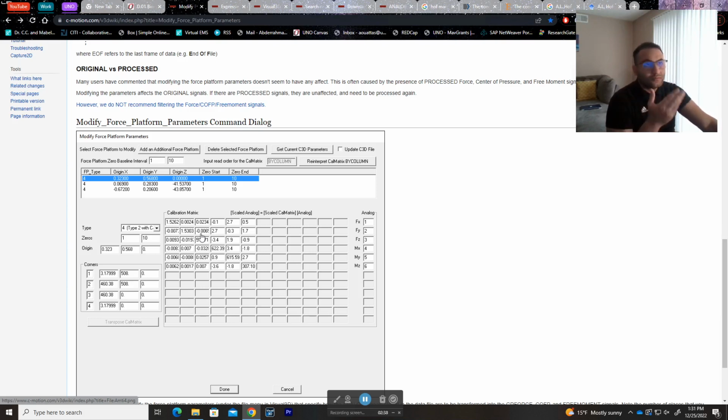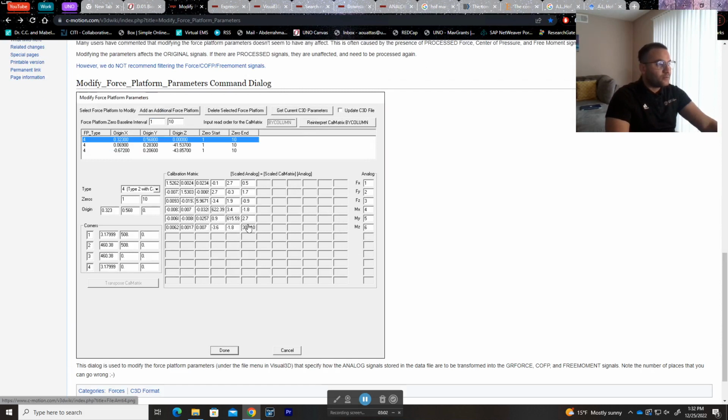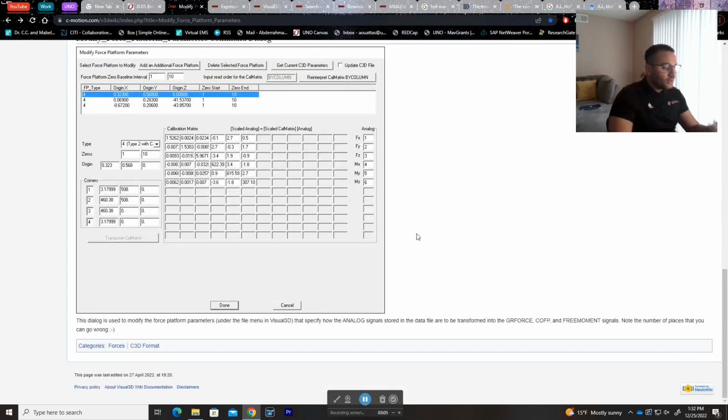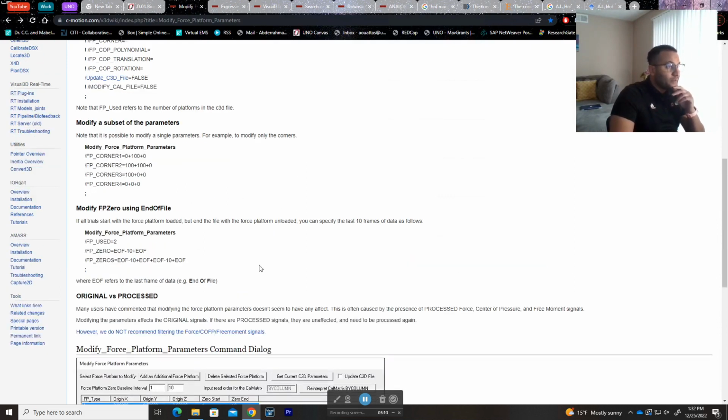So either you had a problem like this, where you forgot to zero the force plate, so you can do it in post-processing, or pre-collection if you want to add a certain platform, or for example if you have a staircase and you want to add certain platforms that are not on the ground, you can access that from this page. All right, but we were focusing specifically on how to adjust the force data to make sure that it starts from 0.